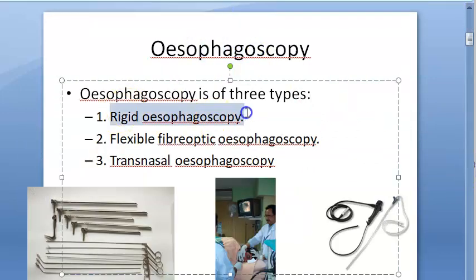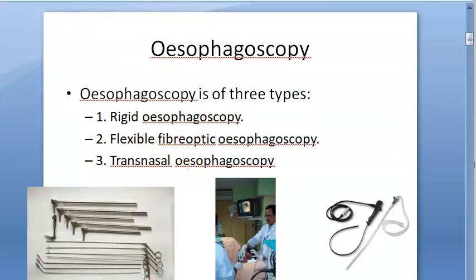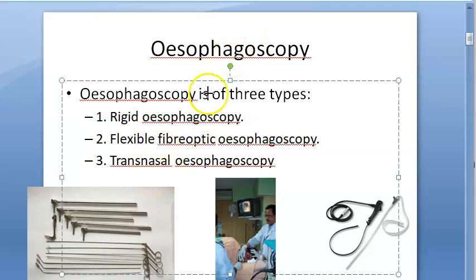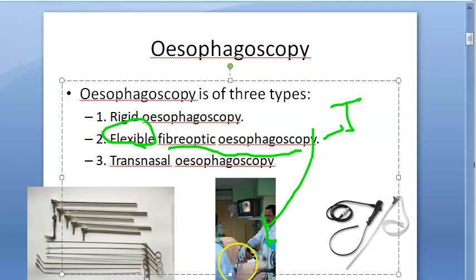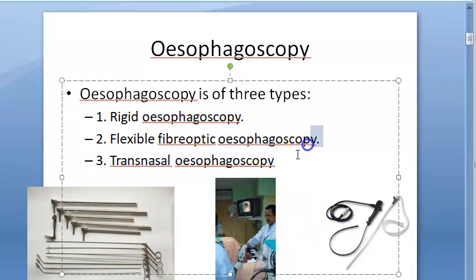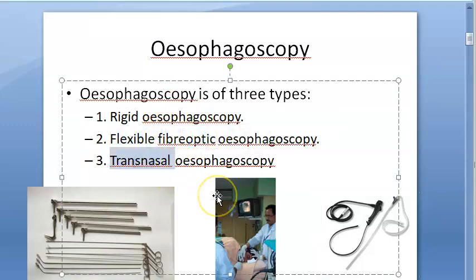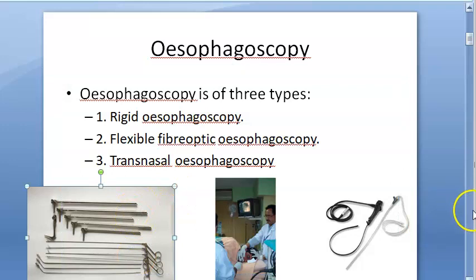There are different types of esophagoscopy: rigid esophagoscopy, flexible, and transnasal. The rigid one requires general anesthesia — you can see how straight these tubes are. The flexible fiber optic esophagoscopy uses fiber optics, is flexible, and can be used with just local anesthetic. The transnasal esophagoscopy uses the same fiber optic flexible technology but goes via the nose.